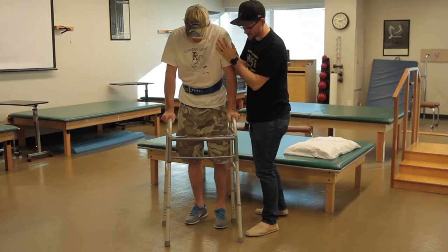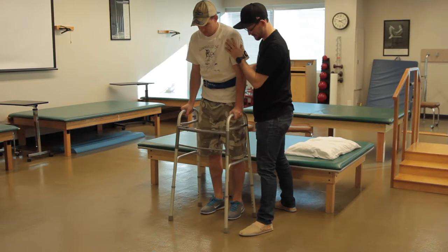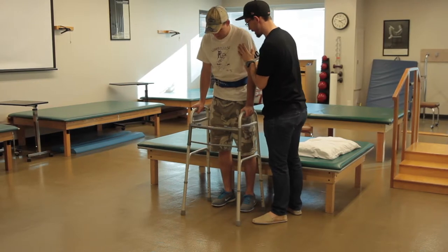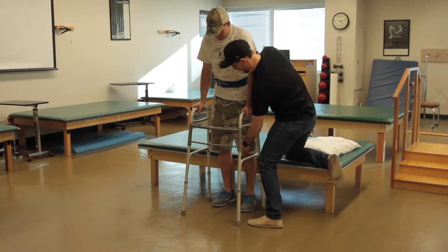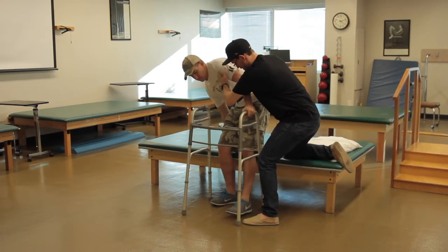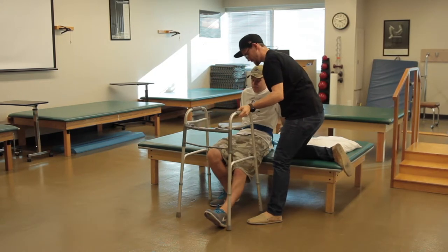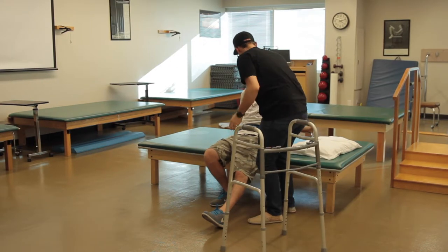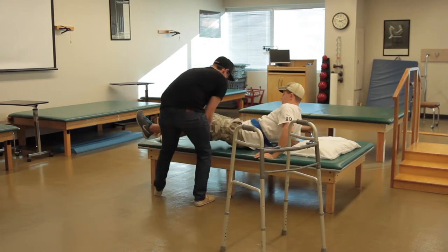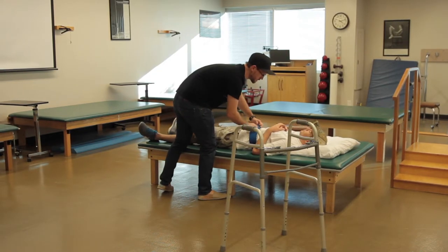And now on the way back, it's just the reverse. So with that right leg, and then left, walker. Then right leg, left, walker. Okay, so now on the way back down, you gotta reach with your right, and then I'll guard, and I'll make sure that that stays straight, okay? All right, I'll move this out of the way. And then same way, going back in. All right, we'll get this off and get out of here.